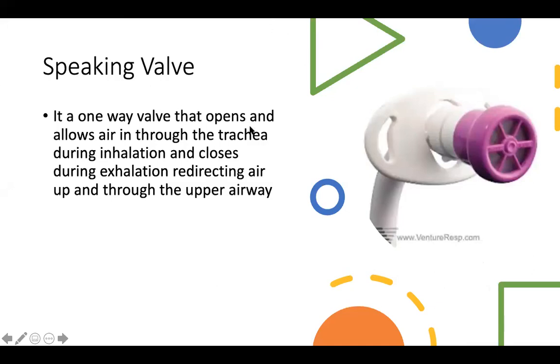So in short, our role is restoring phonation and restoring swallow. To restore phonation, we have to restore that lost upper airway mechanism, right? We said that there is no upper airway circulation anymore when a trach is in. But when we fit a patient with a speaking valve, we restore that upper airway mechanism. We will talk about the benefits of the speaking valve in a minute.